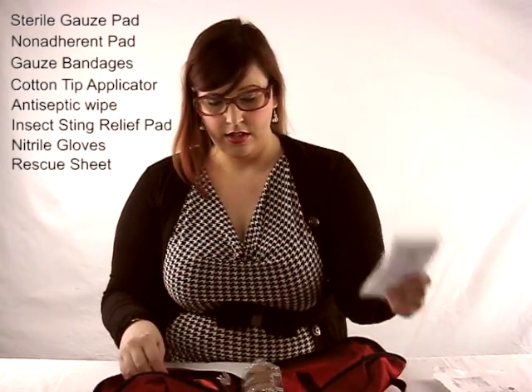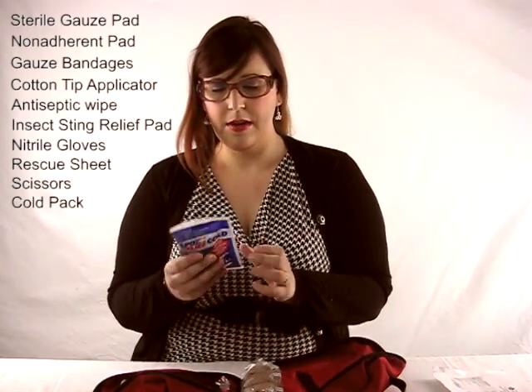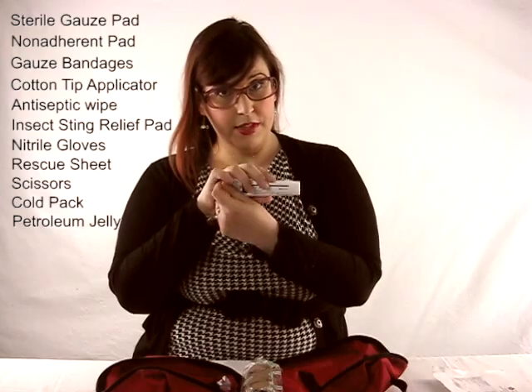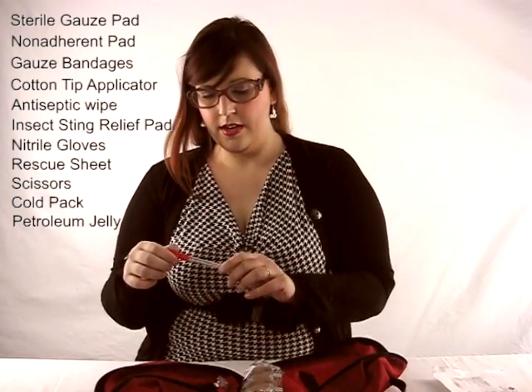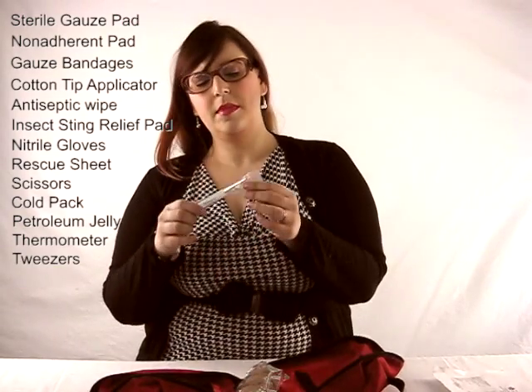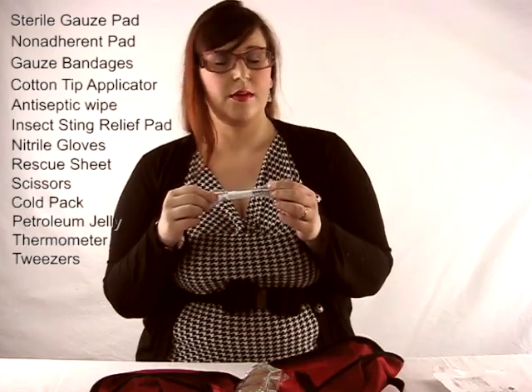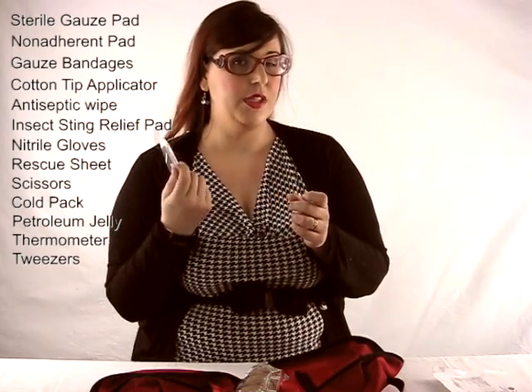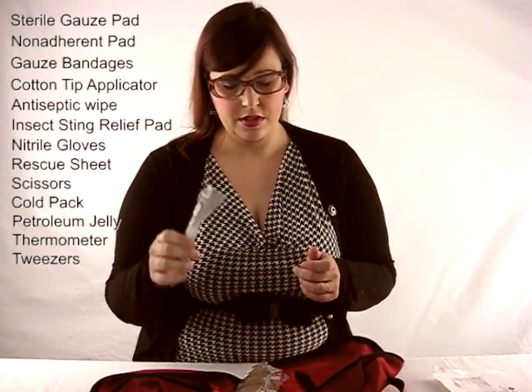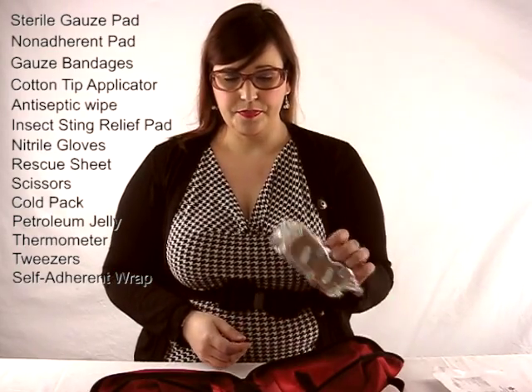On this side I've got a few pairs of gloves, a rescue sheet, a pair of scissors, a rapid relief cold pack that becomes cold pretty quickly, some petroleum jelly, an anal thermometer for pets, and some flathead tweezers which you can use for a variety of things including removing ticks.